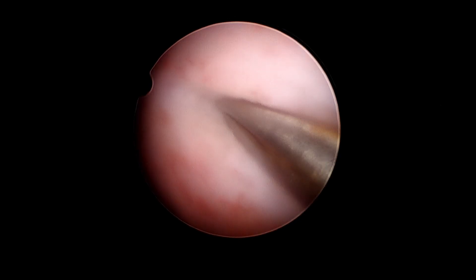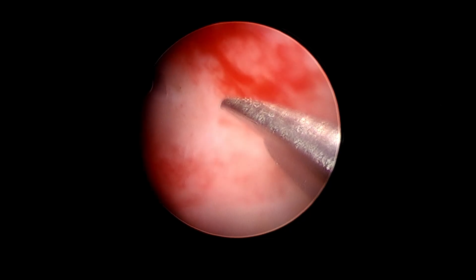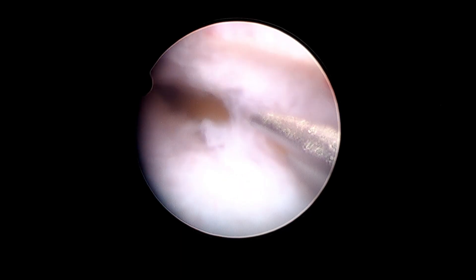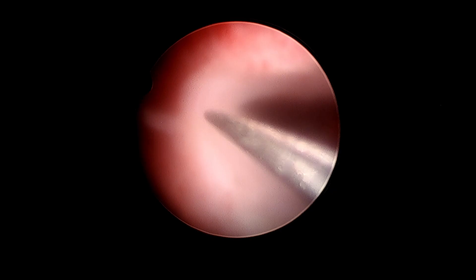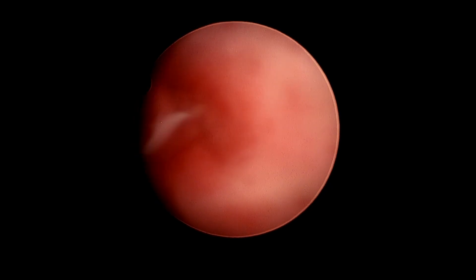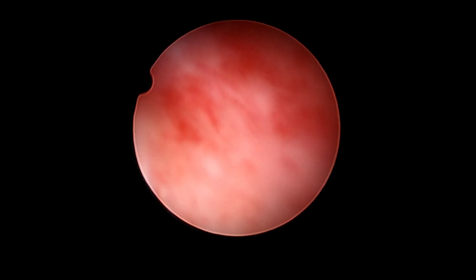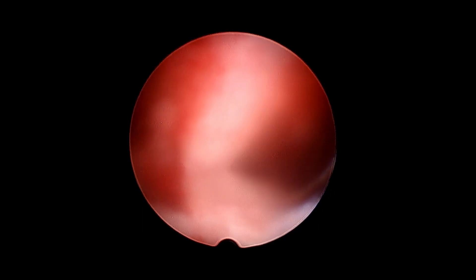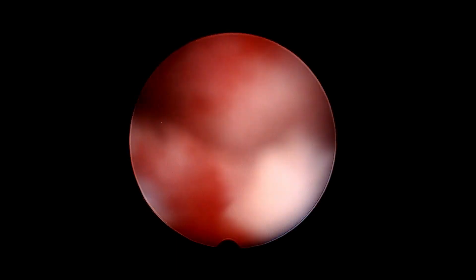Immediately once you give a nick — because this is going to be an absolutely thin portion of the septum — you directly see the Foley's balloon that is on the opposite side of the uterine cavity, on the left horn. Obviously while doing your septoplasty you have to rupture the balloon and take the Foley's catheter away. During this, fluid is going to leak from the other side; to prevent that, you can hold the cervix on the opposite side and twist your Allis clamp. We must also be sure we are giving a nick exactly in the center of the septum so there are no chances of going into a false passage.